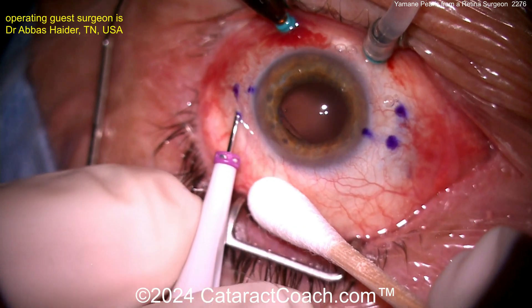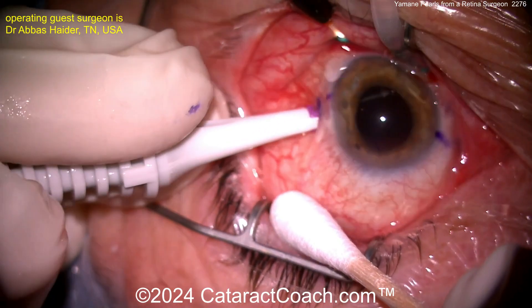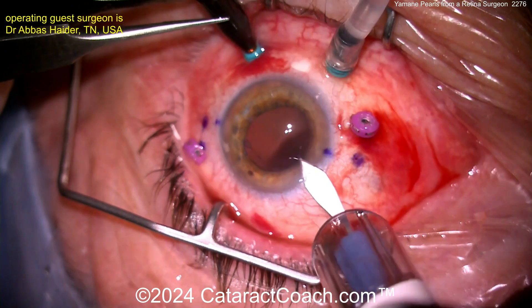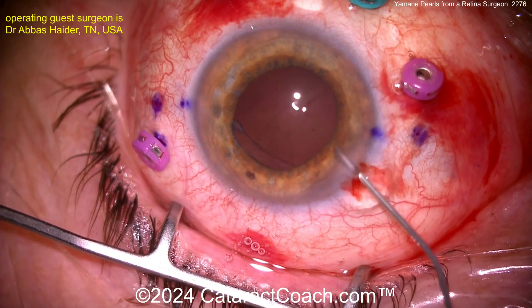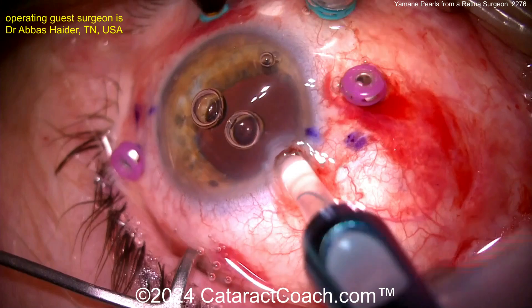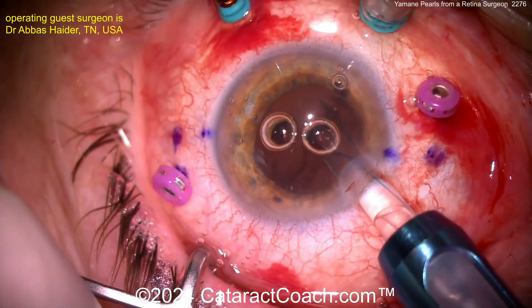He found that doing this with trocars instead of those thin-wall 30-gauge needles makes it a lot easier. He says it's gentler on the haptics — and remember, you don't want to break those haptics. With this technique, you're going to see him leave the trailing haptic outside the eye while externalizing the first haptic, and then manipulate it to better position the leading haptic that's already in the eye.